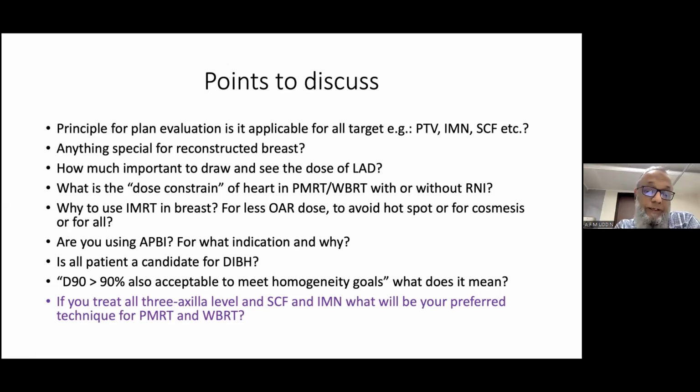So here, the main issue I wanted to bring up for discussion, as Sandeep said, is that in breast cancer we look at the coverage, the dose and the volume of coverage, and also at the dose homogeneity. Why did these things move from 3D to IMRT? Initially it was dose homogeneity, then the outcome came as cosmesis, and that was the method by which we justified forward IMRT.